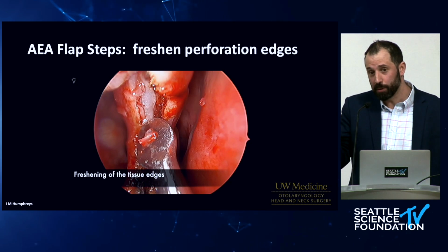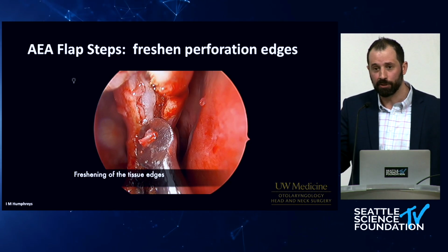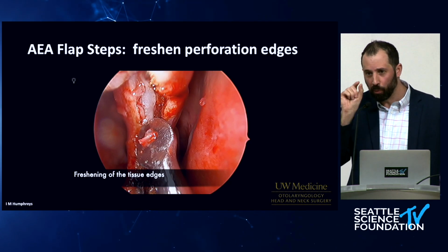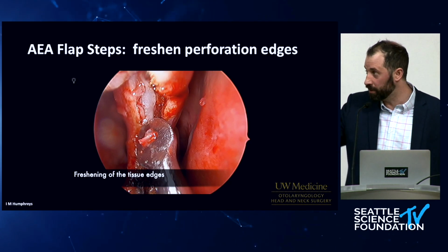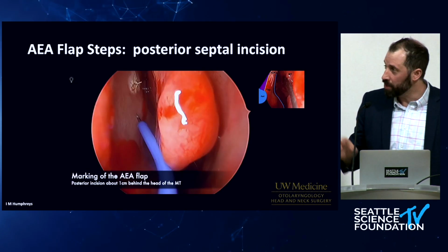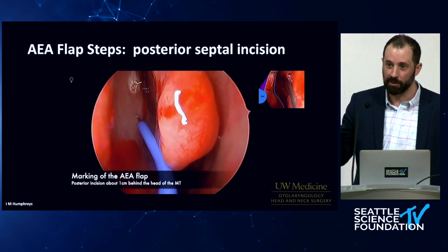It's that anterior one that feels like you're working back that feels the most frustrating. For me, the ball tip probe's been helpful to help mature and develop that. Angled scopes can be helpful to do that as well. But no matter what, it's always going to feel more difficult in that specific area than it does everywhere else around this perforation edge.